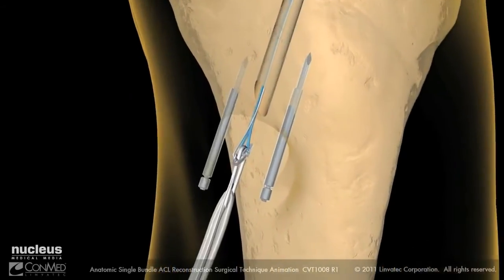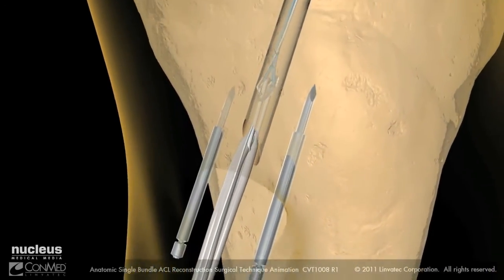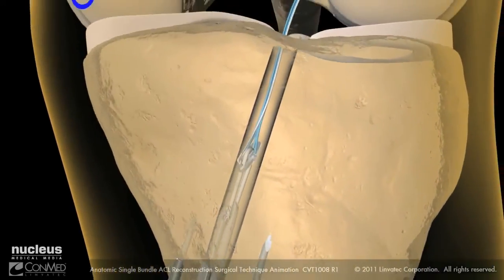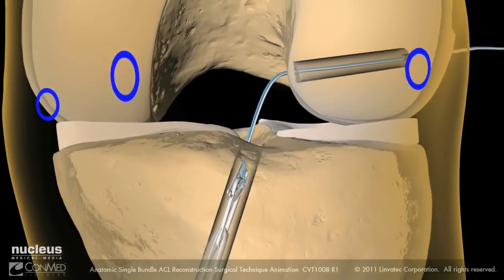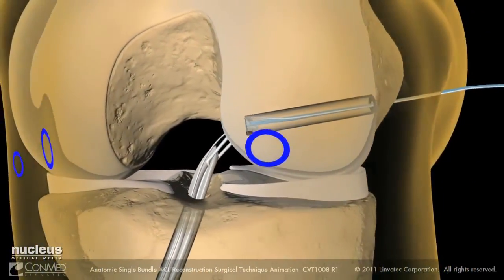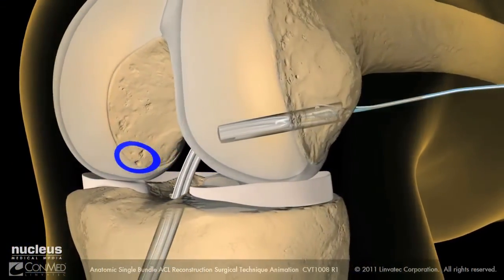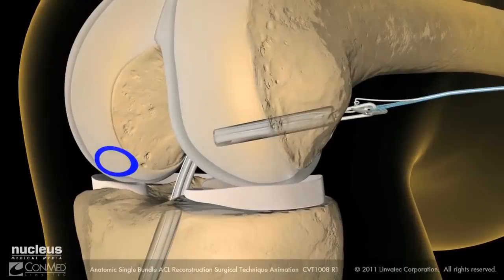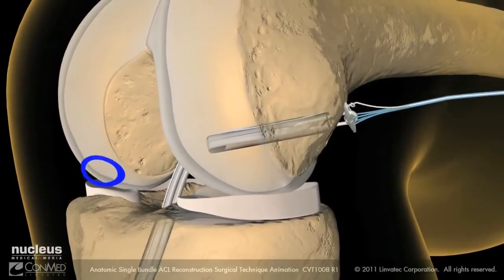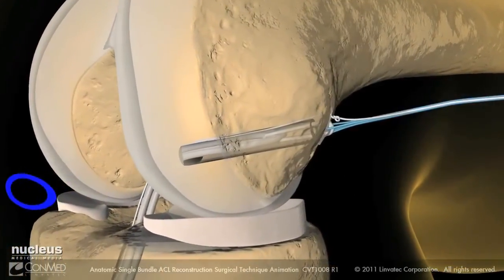Pull the exo-button-loaded graft into the joint and through the femur while hyperflexing and elevating the knee to ease graft passage. Finally, ensure that the exo-button has flipped and is seated.